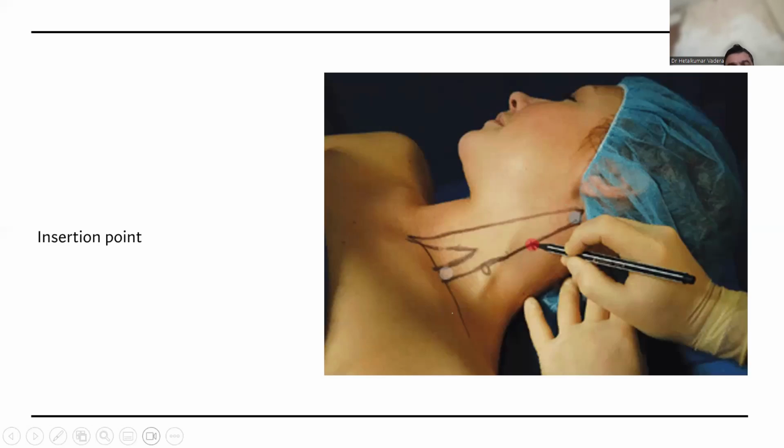Another point I want to make regarding scalp block: when you want to block the greater and lesser occipital nerve, especially in an awake patient, you can ask the patient to be seated. In sitting position, it is easier to block both these nerves in a few seconds only. If a patient is sleeping, then you have to make the patient lateral and change the position twice.